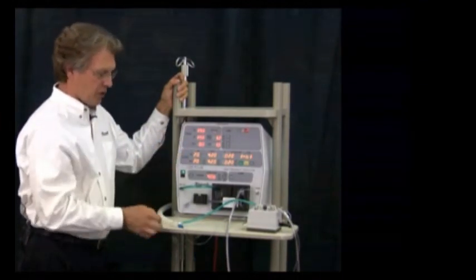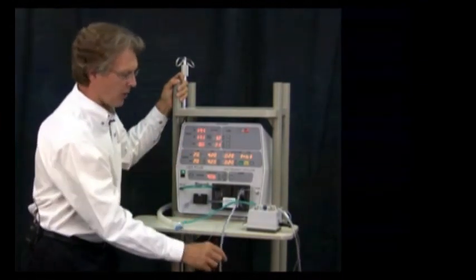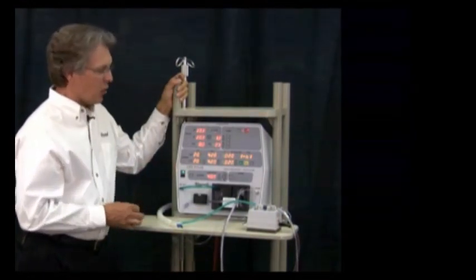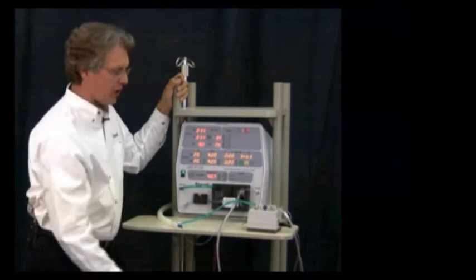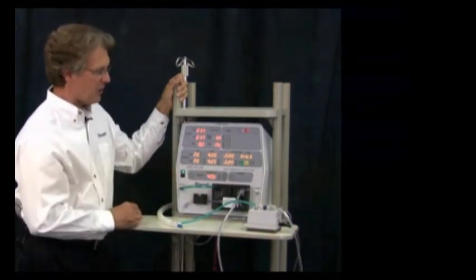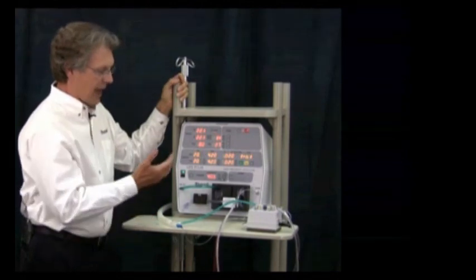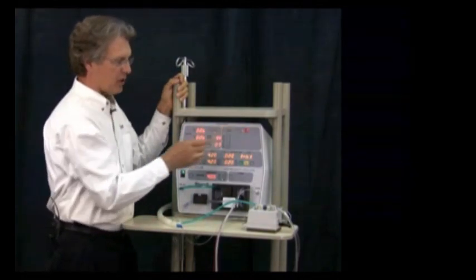It's more efficient to get rid of the excess water in the circuit while the jet's running than while the jet's not running. So if there isn't too much water in the circuit, you can do what I've just demonstrated to remove that excess water, and you can do that safely as long as the ready light's on.